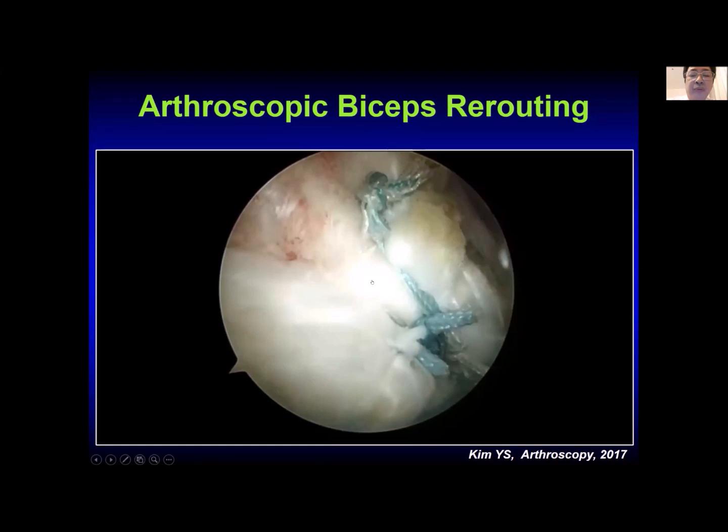And if the patient has a SLAP lesion, like the biceps origin has a little bit of tear, yeah, I repaired the SLAP lesion. The patient is a senior patient, old enough, so I don't like to call it just a SLAP lesion. It's a totally different mechanism and pathogenesis. So for a senior patient with a SLAP lesion, I like to call it a biceps and superior labrum tear. It looks the same, but I don't like the terminology SLAP lesion for an old patient. So I repair the torn superior labrum lesion when I apply the BL technique.